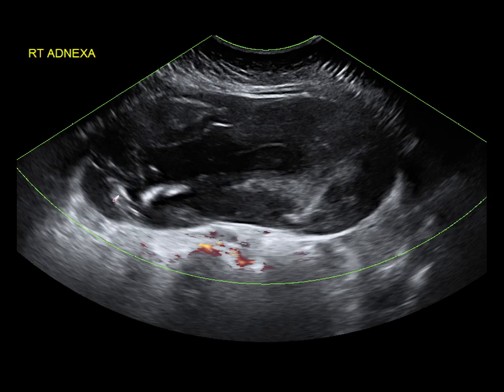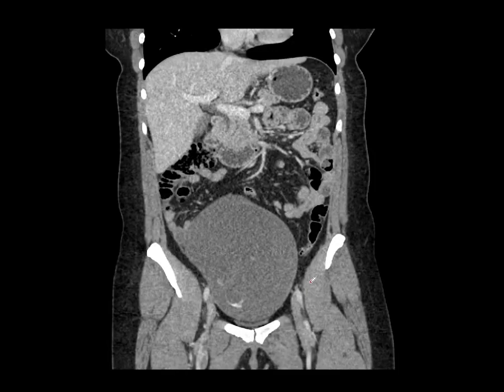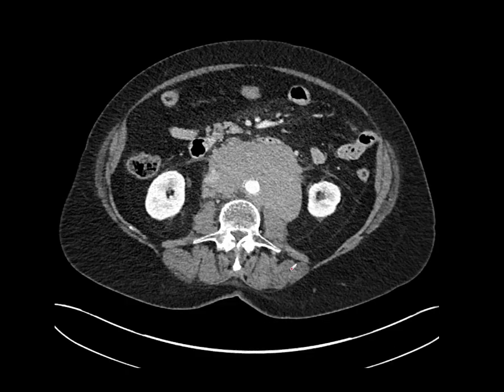Here's a patient with a large mucinous carcinoma. So this is actually a transabdominal scan. This was large enough to see on a transabdominal image, and here we are on the transvaginal scan. You can see large tumour with irregular contents internally, and this is the sort of appearance that you often see, the sort of mucinous appearance that you can see in these tumours. Here's that patient. You can see a focus of calcification within the lesion, and that's a characteristic finding that you see in mucinous carcinomas, and we'll see that in future videos as well.